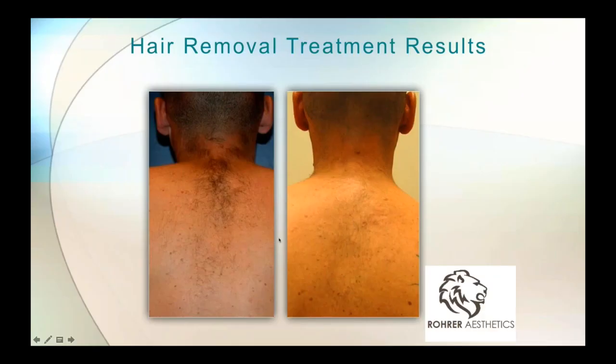This is very good. And just once again, for those of you that may not do a lot of laser hair removal, you have to treat them about 6 times with the treatment times separated by 6 or 8 weeks. And then you retreat, because you have to keep in mind there's only a percentage of your hair follicles that are active at any given time. And then once you get through that additional treatment schedule, you then just treat on a much reduced, like, yearly schedule to keep things away.